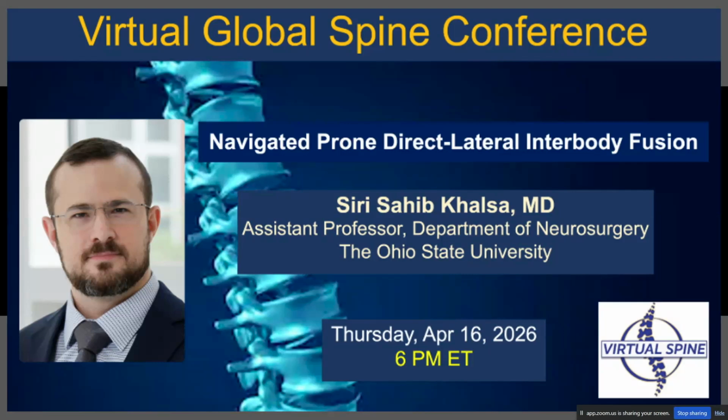No, yeah, I love that. Thank you for sharing. I'll have to give it a try. Yeah, a great one to start with is the L3 level. If you've got an L3, say non-union or really deformed vertebral body you need to remove, I think that's really the perfect level for it, because the rib's not really in the way too much. You can get nice wide retraction. I think sometimes at other levels, particularly say L2, or you're going up higher, if the ribs are in the way, you've got to do a rib resection, particularly in older patients, to get them out. Which not everyone likes doing, but I've had to do a few times.